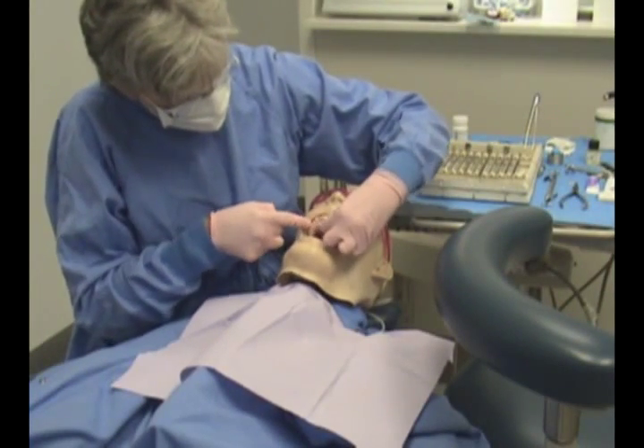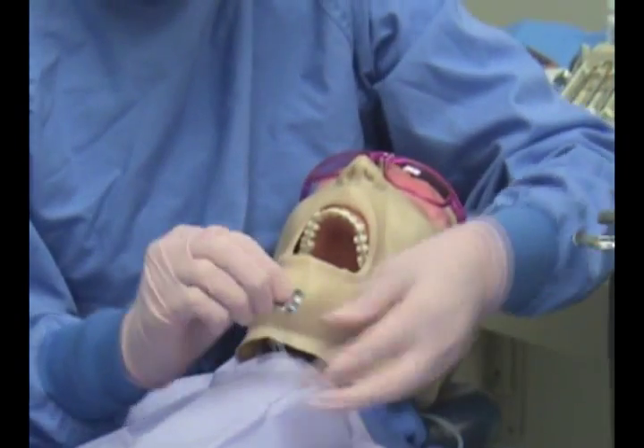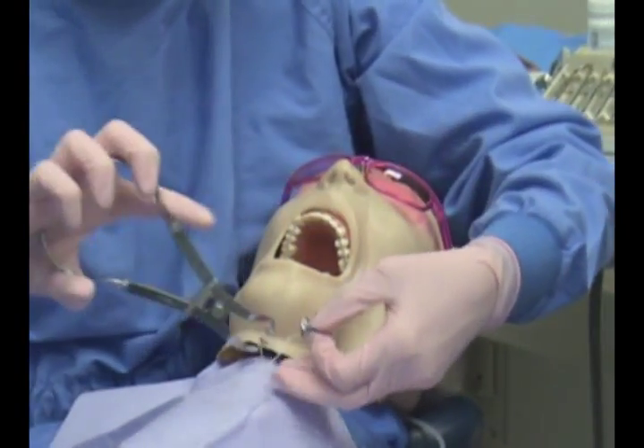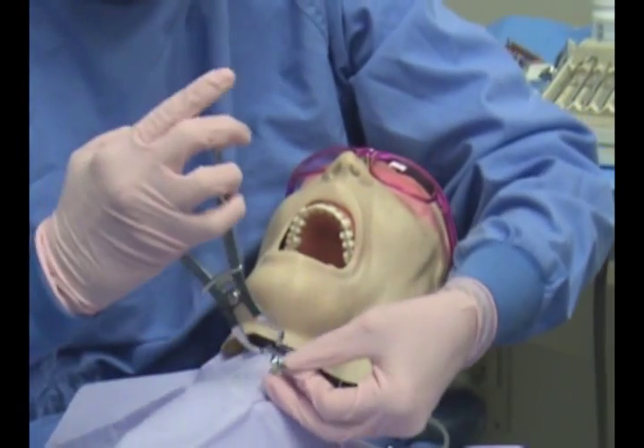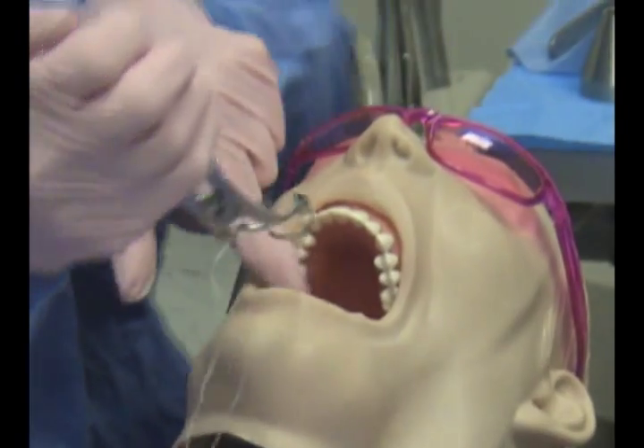In this procedure, we will place a rubber dam on our patient. After selecting the proper clamp, the clamp is going to be placed on a tooth that is posterior to the one we are working on.